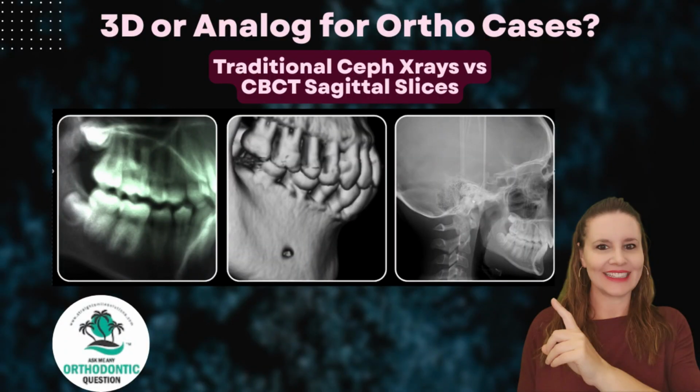Amanda with Straightsmile Solutions, straightsmilesolutions.com, and today we're going to talk about the difference between traditional Cephs and a CBCT sagittal slice for your orthodontics cases or Invisalign cases.